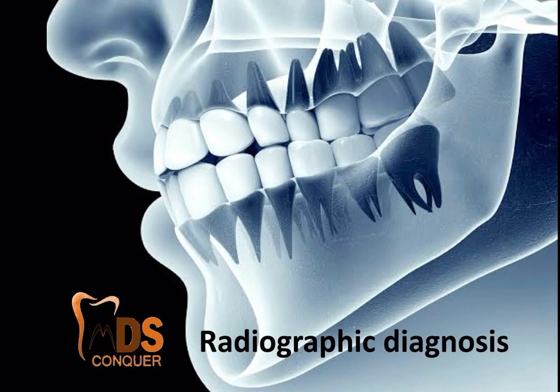So the next topic that I am going to discuss is the radiographic diagnosis. What exactly do you mean by radiographic diagnosis? It's nothing but when a radiograph is given to you, you have to interpret the radiograph, get your findings, and give your diagnosis only based on the findings that you get from your radiograph. So that is nothing but the radiographic findings. It's not the final diagnosis, it's just the diagnosis based on the interpretation and the findings that you get in your radiograph.